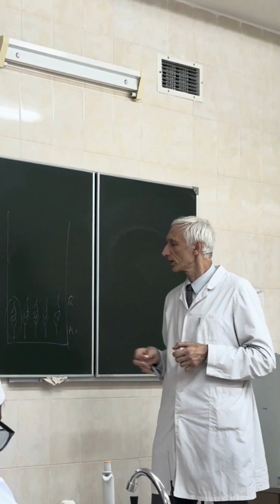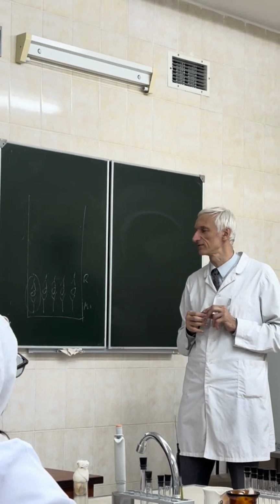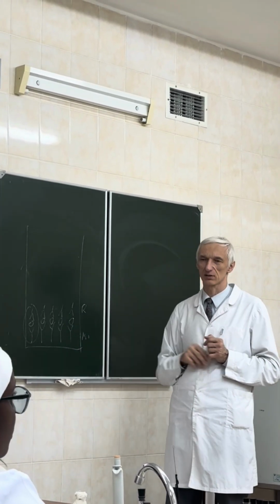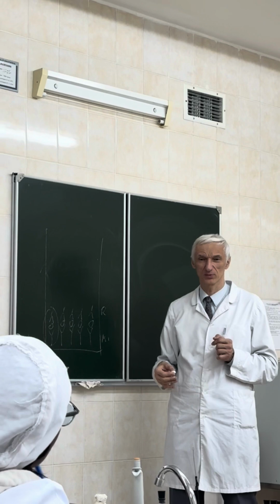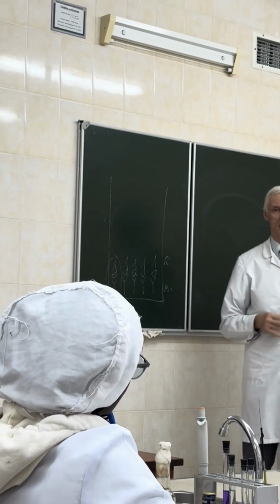So that's why. Okay, people, still at this moment and even this moment, the complex is still invisible. What will be the next reagent? This is murine, this is antigen, this is rabbit antibodies. Anti-what? Antigen has no place for binding. All antibody active site paratopes are engaged in binding.